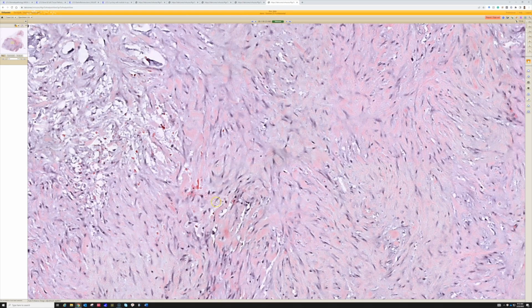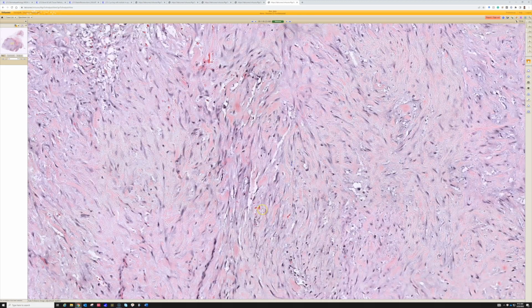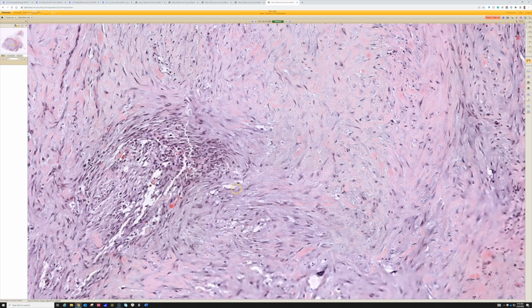It is usually present. Extravasated erythrocytes scattered in the lesion are commonly present, although you can see that in other things. So I personally don't find that super helpful, but I know some pathologists who really like that feature. I really focus on the myxoid cystic change.